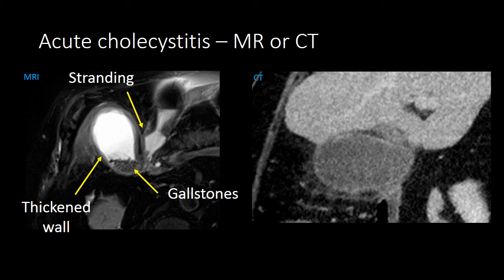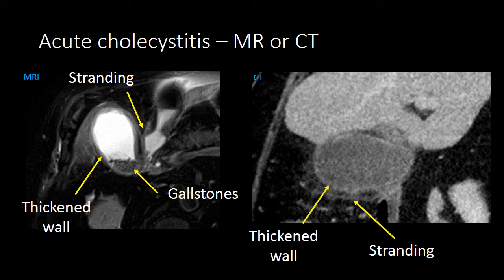In the other example, we may not be able to see the gallstones on CT, but we can identify the stranding adjacent to the gallbladder and gallbladder wall thickening. In both of these cases, the patient had acute cholecystitis.